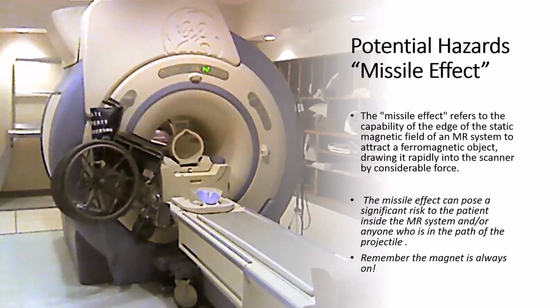So do you think there might be any potential hazards with the magnet being on? Something like the missile effect? Take a look at this image and you can see what the missile effect is. Metal objects are attracted by the magnet and they're drawn in with rapid force. You'd hate to be in the magnet when someone walked in who had a scalpel, say, in their pocket, and all of a sudden it was projected towards you.